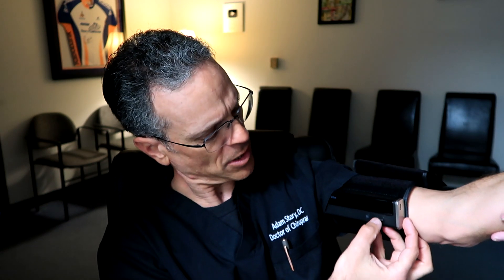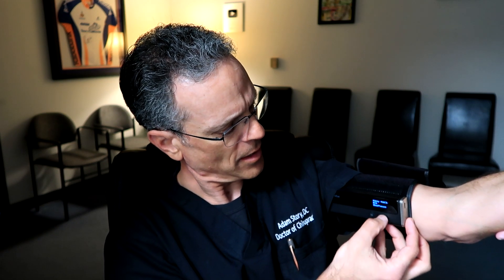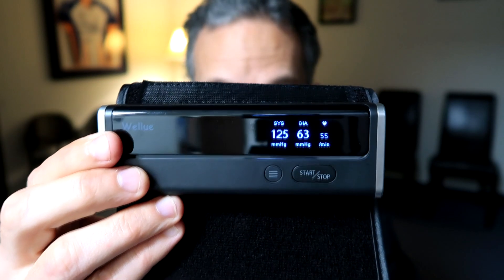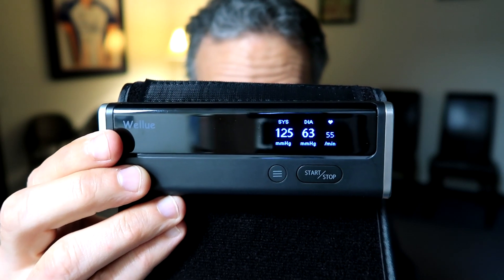My lovely assistant is going to hold my arm at heart level. This is so easy — you just hit start/stop and it starts working. Let me show you what the numbers were. 125 over 63. And there's a pulse too — 55 beats per minute. That's how you use it for blood pressure.